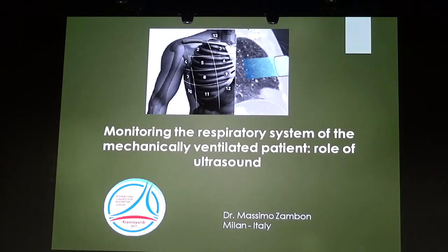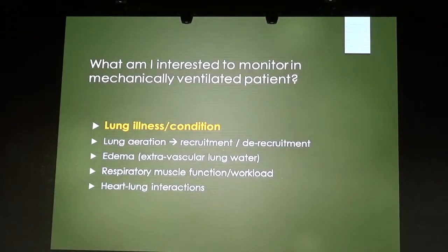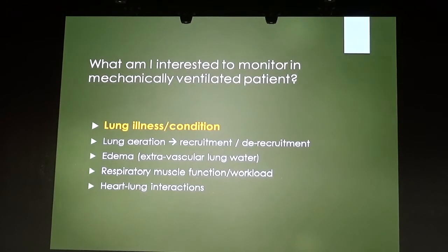Well, actually, I will do a brief overview of the role of ultrasound in monitoring the respiratory system, so not only the diaphragm, because I consider the diaphragm cannot be separated from the lung conditions and even from the heart conditions. So the first question I should answer is, what am I interested to monitor in a mechanically ventilated patient?